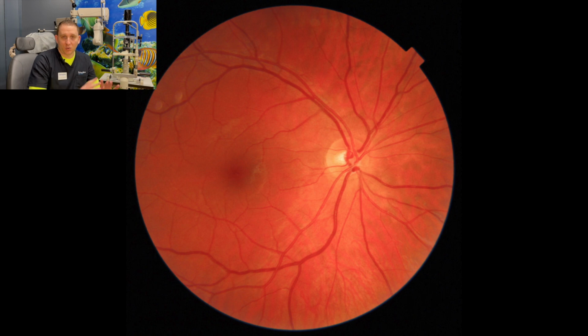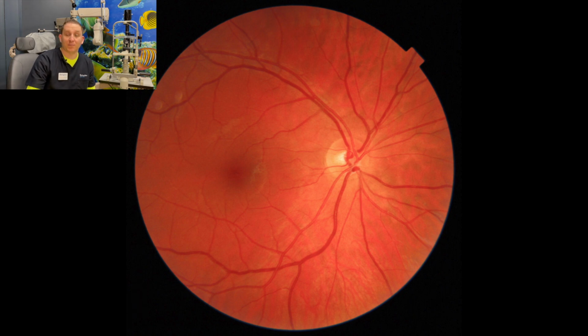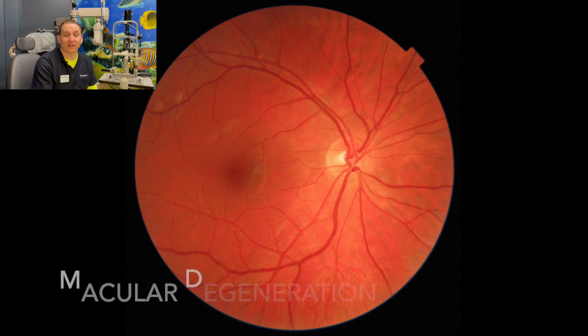You also see, obviously, the orange colored part of the picture called the retina. It actually goes further beyond that, but this is just what we refer to as the posterior pole, the entire image here. And then you'll see the darkened portion in the middle of the retina called the macula. This is actually your high definition viewing vision. It's where you're going to get your best vision from. What you see when you drive, when you read, when you get on the computer, when you're on your phone, when you stitch, when you crochet. Things of this nature are what you use the macula for, which is where we watch for macular degeneration.